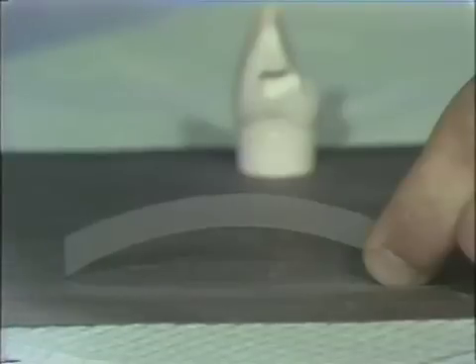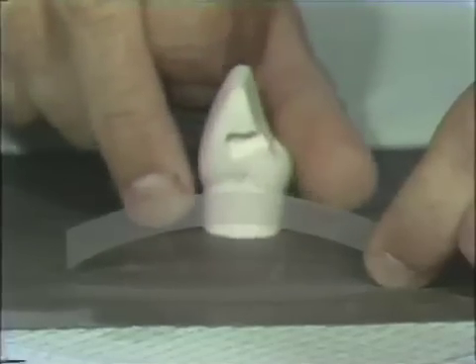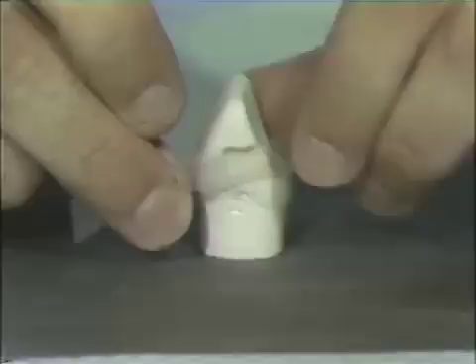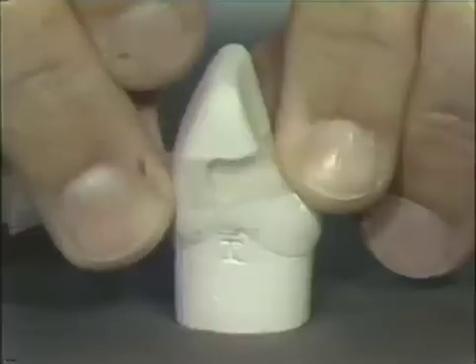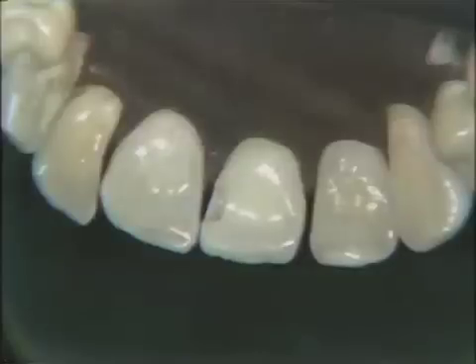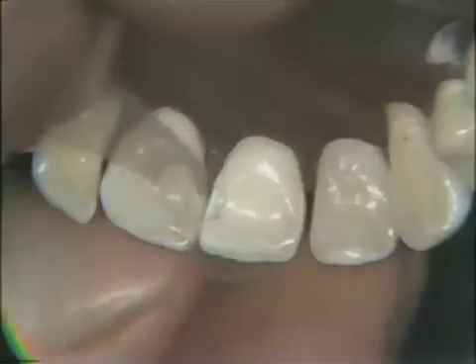Matrix replacement. The matrix, of course, is of extreme importance because this really is the beginning of the finishing of your preparation. Now, on your model, we have a curved matrix. We will pre-test the matrix in the mouth. We'll show you that in just a moment. But note how they pull this matrix. You will place it on the tooth, and you will put the pressure on the lingual or labial opening, whichever you have, and then pull the strip.